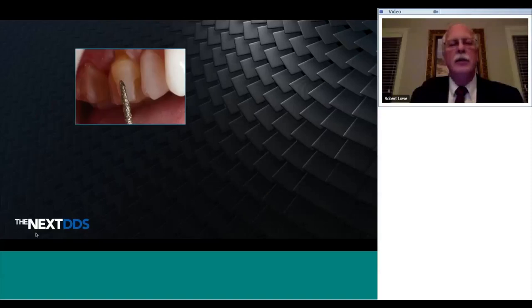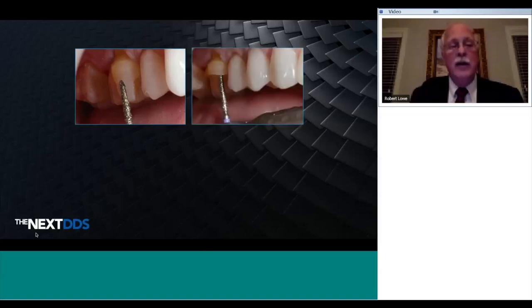Single tooth restoration. Let's look at preparation. I was taught in dental school to prepare wrong, I think. We were taught all about the margin. It's not just about the margin. You've got to make the tooth smaller, but in anatomic form, so that you replace the lost anatomy with a uniform thickness of restorative material. I believe in depth cuts. You will see that in the rest of our webinar.